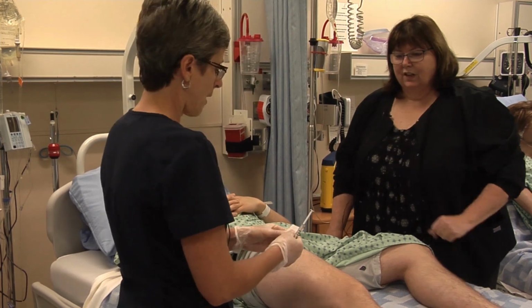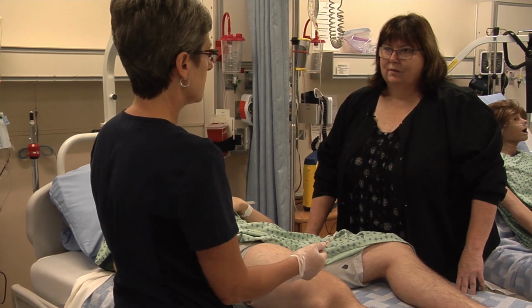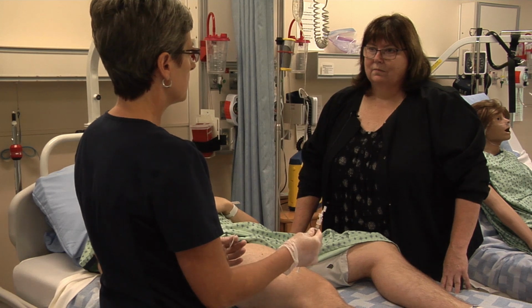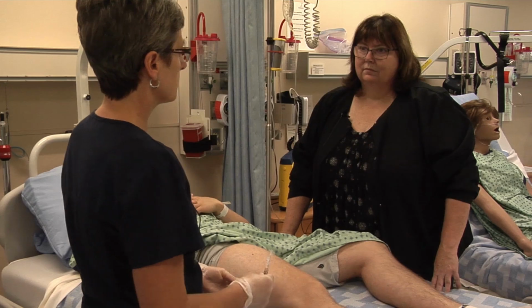So I see you've engaged your safety there. Yep, never recap a needle. And if in a situation you absolutely have to, it has to be that scoop cap. Okay. Yeah, but engage your needle and then dispose of the whole thing into the sharps. Okay.